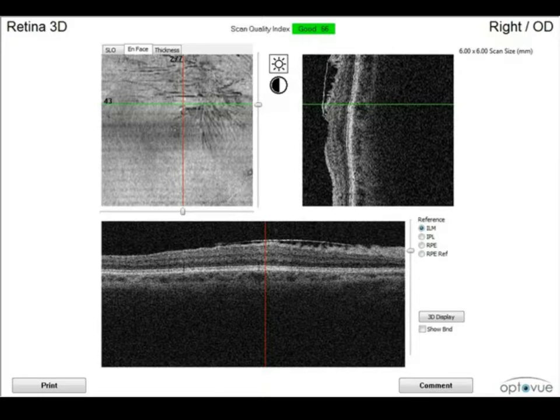It's almost like you're looking at the surface of the retina, again, looking down at it. And you can see how there's a crinkling appearance, almost like you have cellophane on the surface of the retina and you're actually pulling it in that upper right corner. These are things that you just miss. It's just difficult to see these sometimes on clinical inspection with these individuals. So we're fortunate that we have the ability to run these wellness scans on individuals and catch some of these things prior to even detecting them on the physical examination.